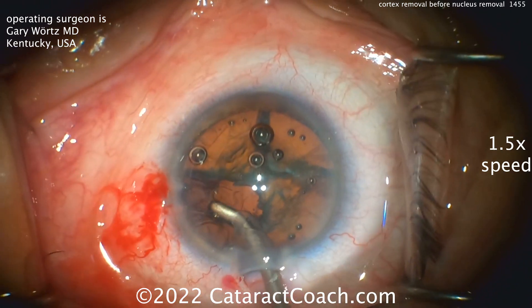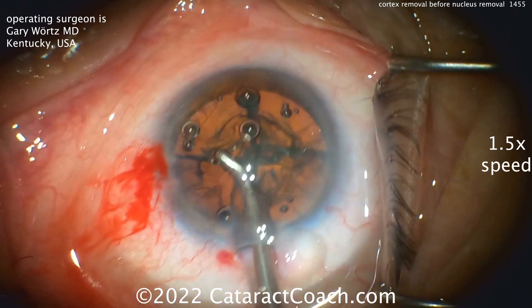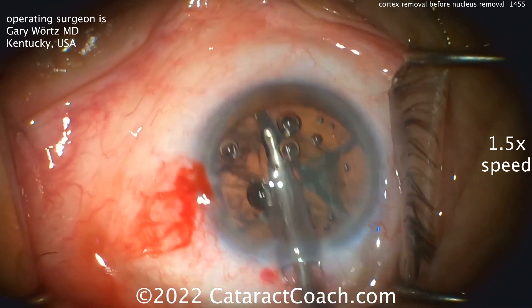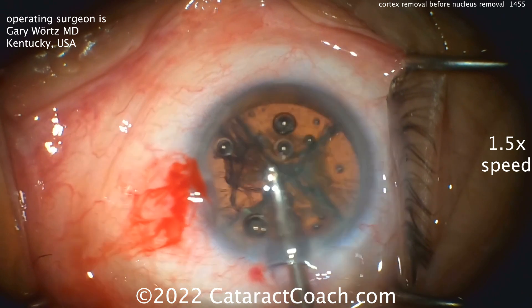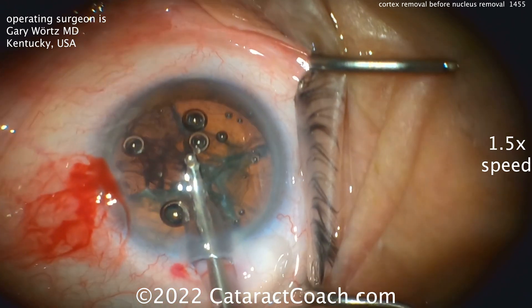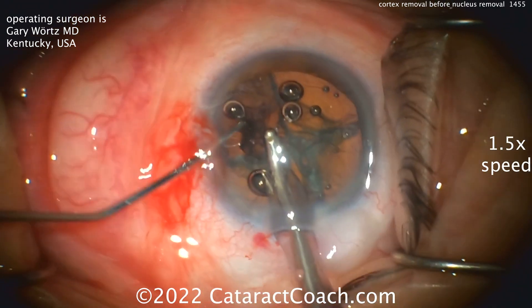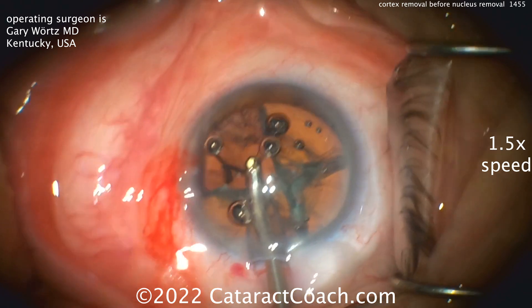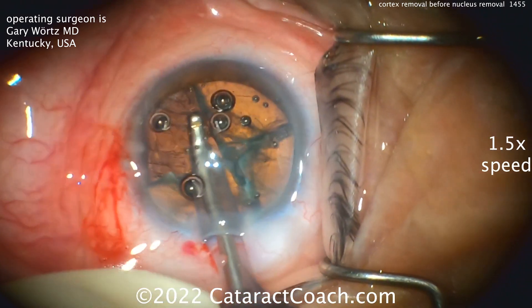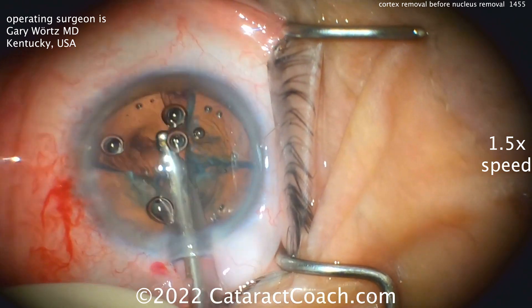The surgeon here is Dr. Gary Wörtz. Notice how he's doing cortex removal even though there are three of the four quadrants of the nucleus left in the bag. Why would you do that? Well, the patient's less than cooperative — lots of movement going on — and he thought he had a neat idea: with one quadrant gone, he could just remove the cortex and use the three remaining lens quadrants to weigh down and hold the capsular bag in place.